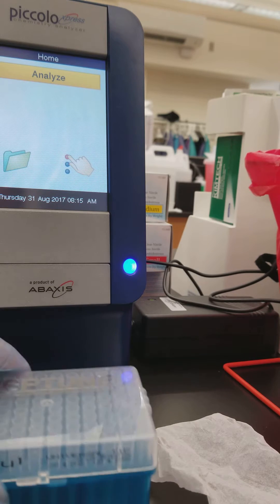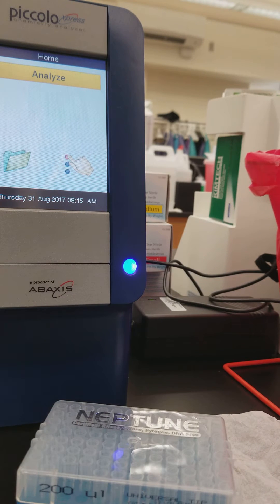Hi everyone. Today we're going to be talking about the Aboxus Piccolo. It's a point-of-care chemistry analyzer.